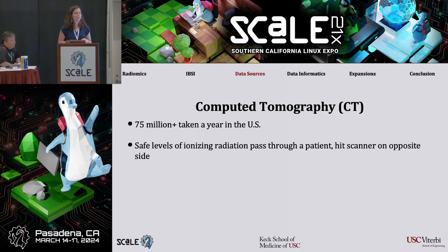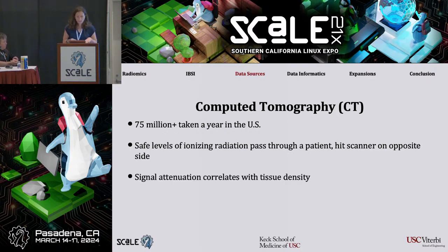mathematically sticky than MR. So starting with this, knowing we kind of have this ground truth of, okay, density and the pixel intensity are correlated with that signal attenuation. And then as all of these 1D signals are collected, a reconstruction algorithm is applied and then pops out the image we know and love that radiologists can use to make diagnoses.